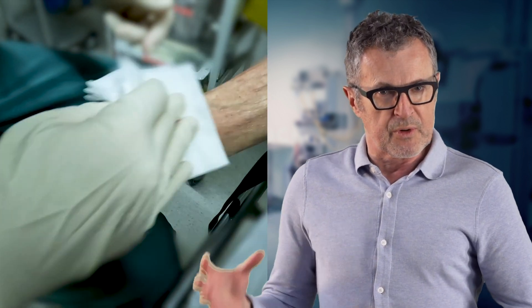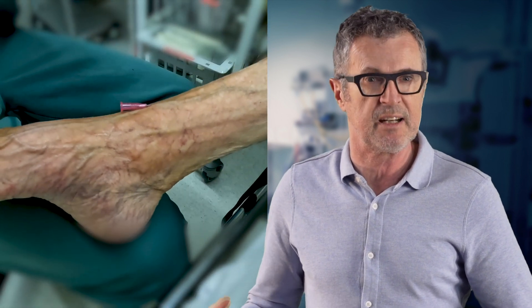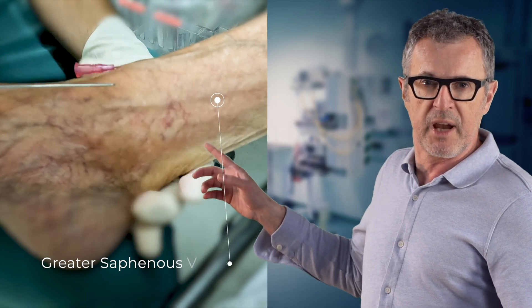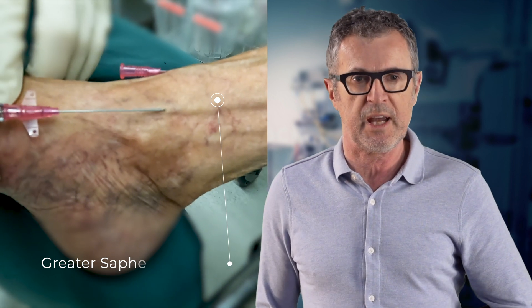We are going to re-prep the foot with an antiseptic and select a new vein for a second attempt. We have several options for veins here, but the greater saphenous vein looks good, and that is exactly what we are going to cannulate.